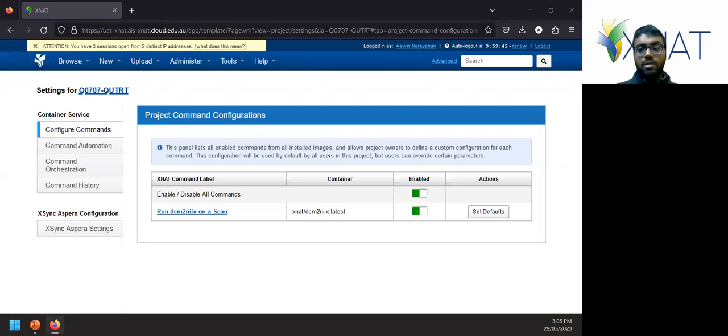There was another question. To use the XNAT desktop client, we need to enter the XNAT server, our username and password. So that's where the alias tokens come in. The XNAT server address is xnat.rcc.uq.edu.au, but for username and password, you'll have to use an alias token. So you generate an alias token and use the alias and the secret. The alias tokens last for 60 days, and you can just generate a new one and use that from then on.